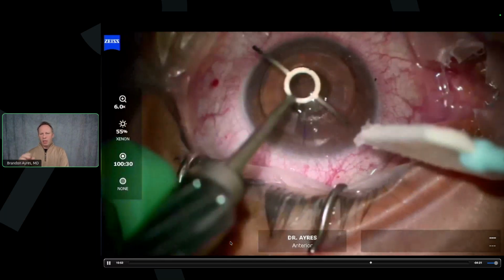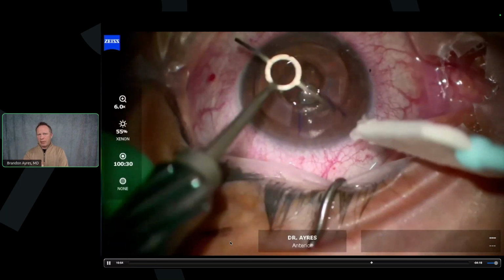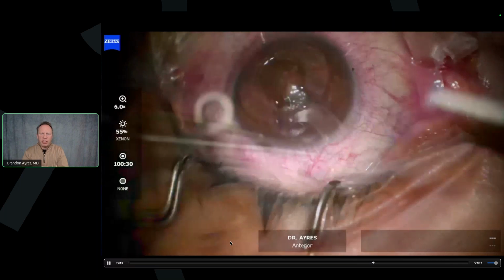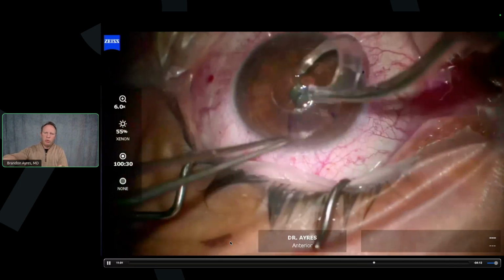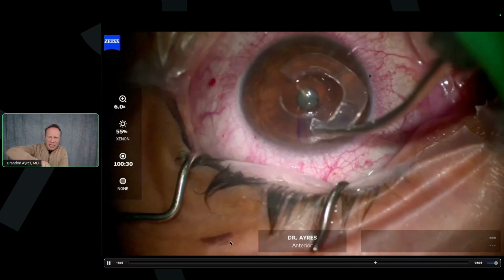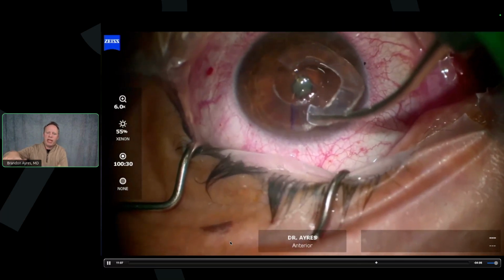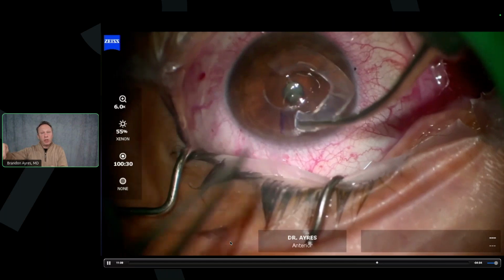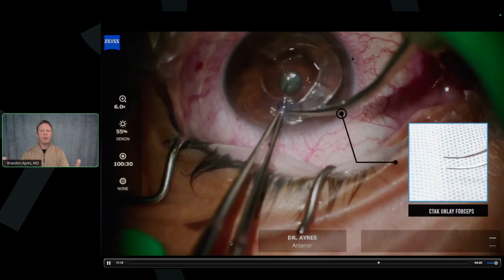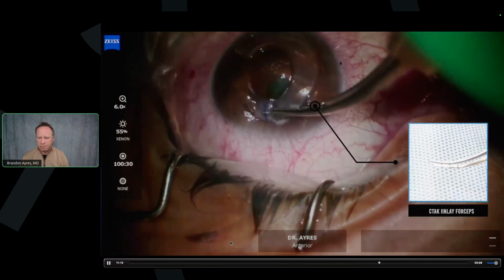Because when you place the CTAK segment into the lamellar channel, it sort of scrunches up on itself, and you'll use a little smoothing device to smooth it out, and it's going to extend its way around that channel. But I want to know about where it's supposed to end, so I know when I have that CTAK segment completely relaxed into the channel.